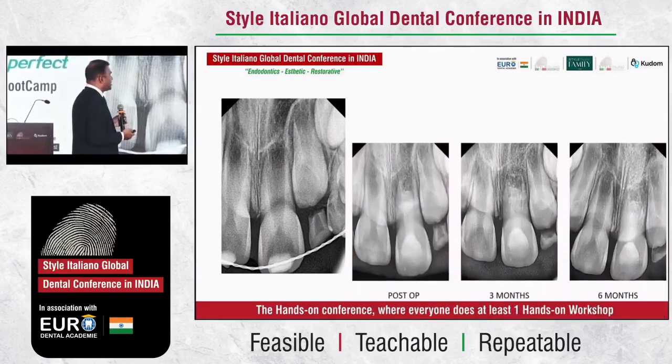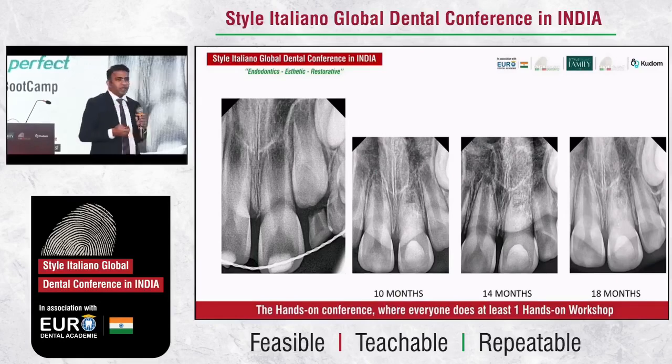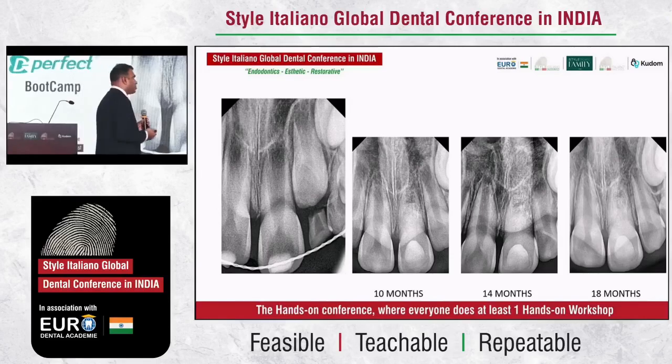And this is an 18-month follow-up where again we can start to see repair and the architecture of the root starting to appear.